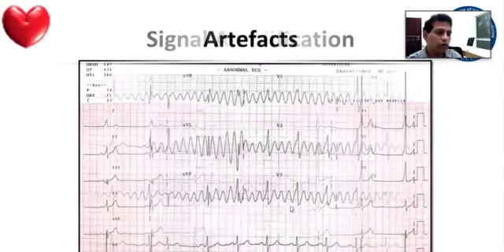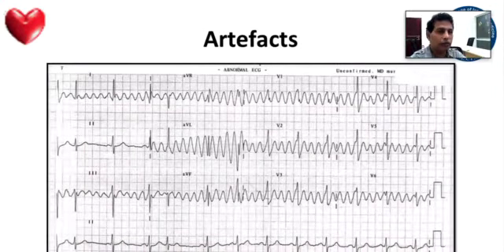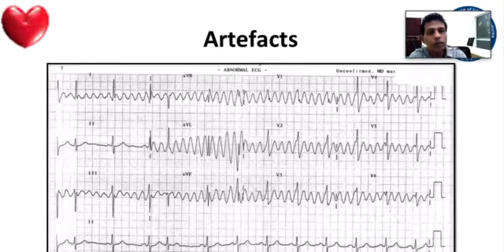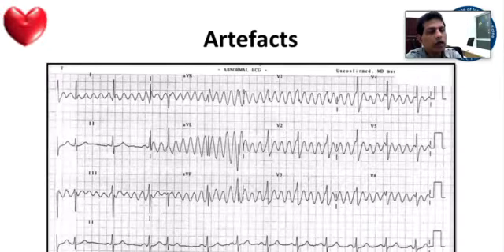Now, what do you think about this ECG? This is an ECG from when I was doing my postgraduate training. This patient was sent to us for an ICD implantation, saying that the patient was having recurrent VT. But actually this is an artifact.